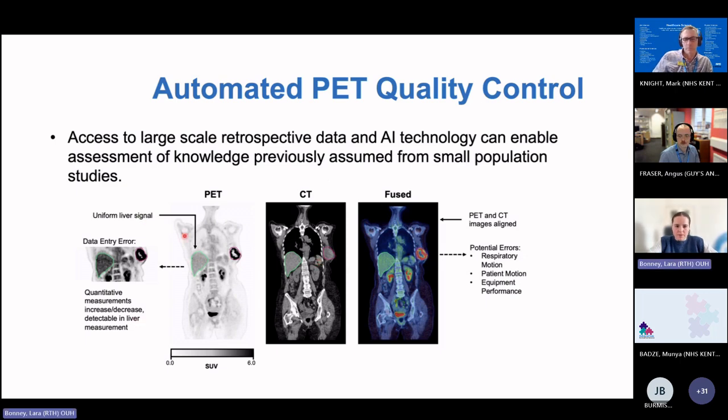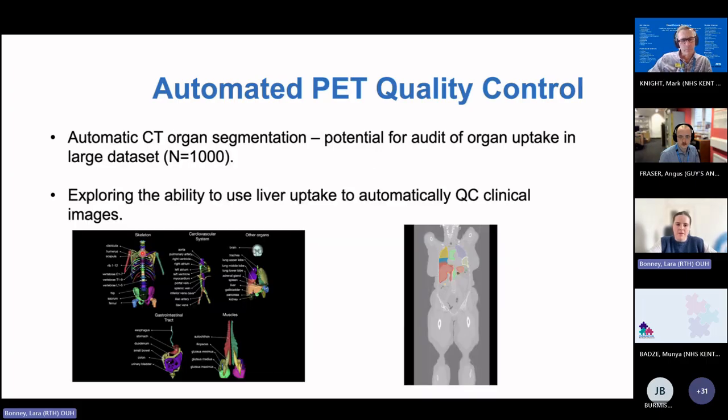We've primarily focused on this liver measurement at the time being. And this is plausible now because there are automated organ segmentation approaches out there that are very easy to use, and very resource cheap. It doesn't take you time anymore outlining these organs, which can take a huge amount of time. You can apply these, leave it for a few days and come back and that's been done for you, and they're very highly accurate.